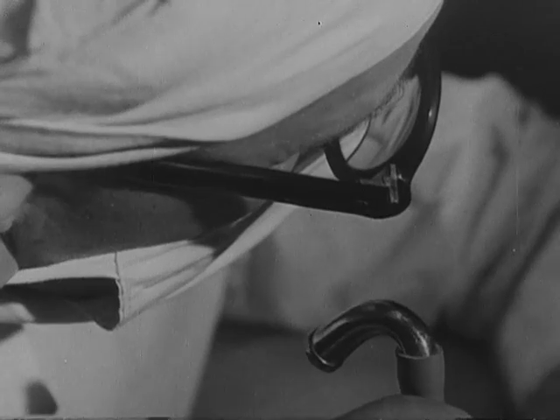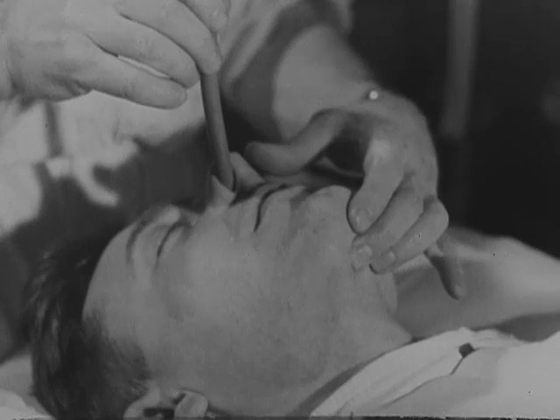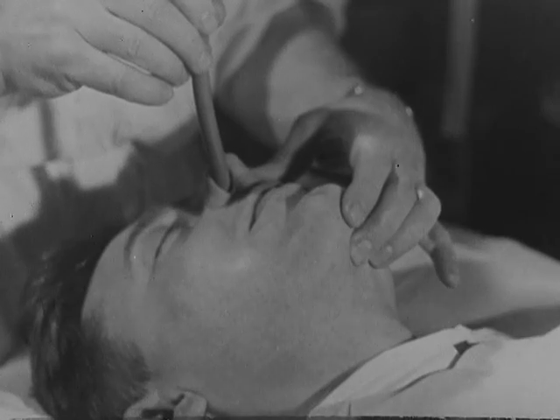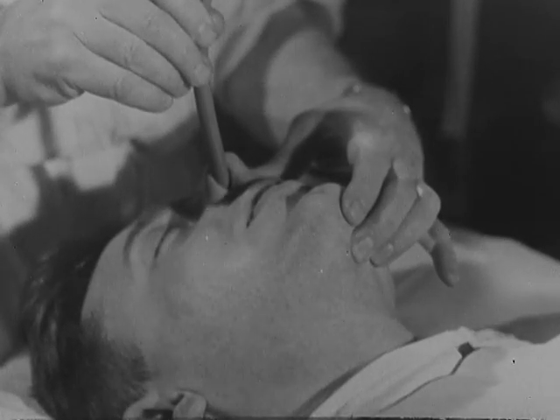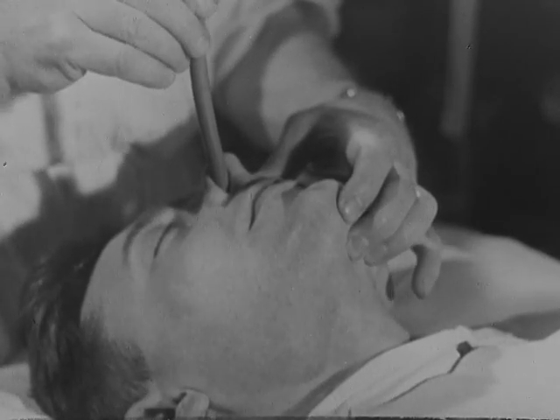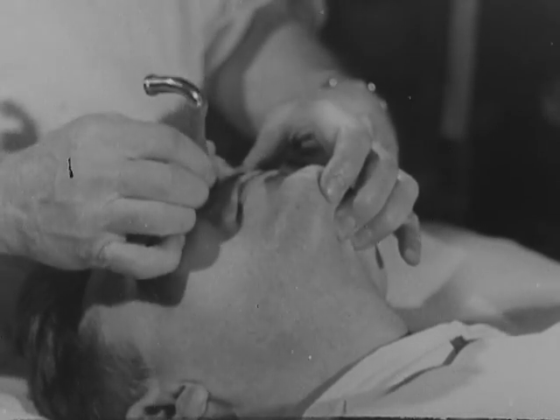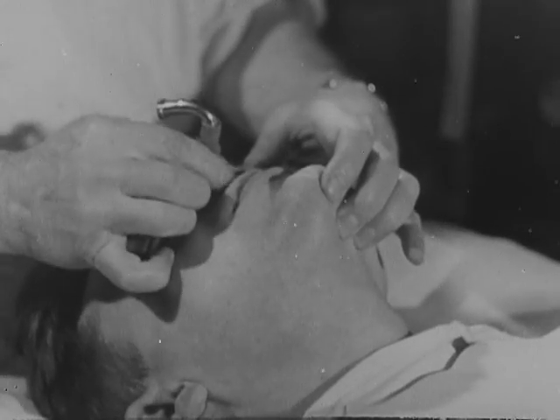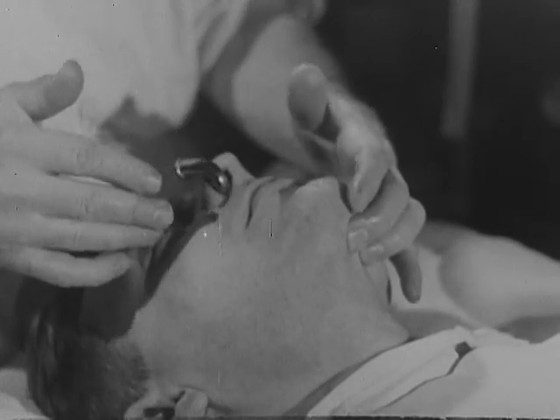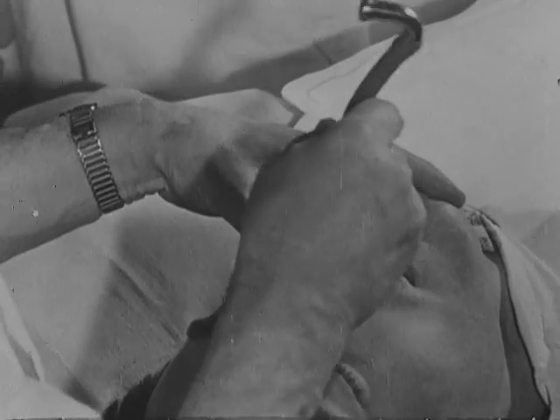may be steadily advanced. But if the breath sounds diminish in intensity, the tube is no longer advancing towards the glottic opening. The tube is then withdrawn a little and rotated slightly. During the rotation, the distal end of the tube should pass over the glottic opening. The breath sounds suddenly increase. The rotary movement is arrested and the tube is slipped in. Here again, we repeat the blind intubation done at normal speed.